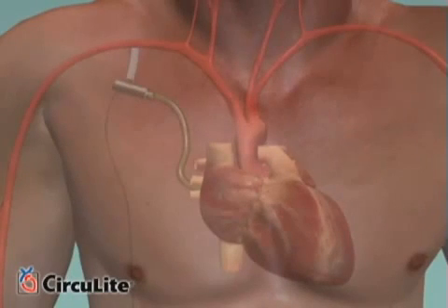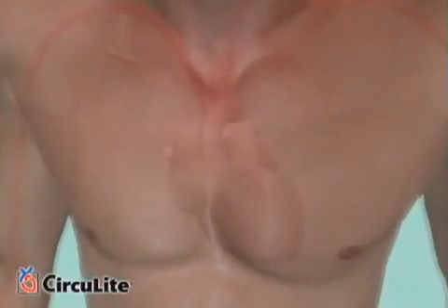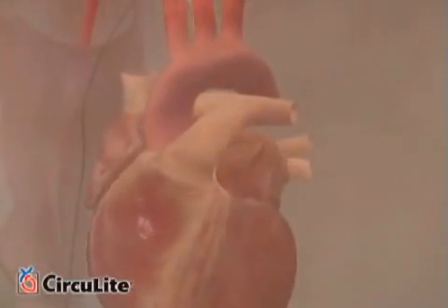Let's see how Synergy works to enable the heart to rest and potentially enable beneficial recovery of heart function in patients with New York Heart Association Class 3B or early Class 4 heart failure.